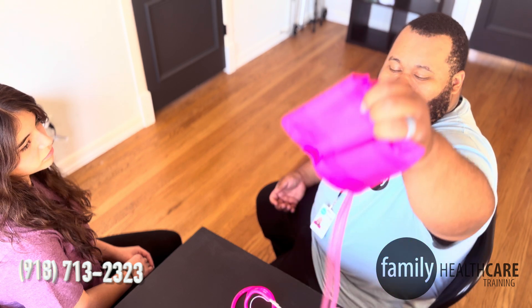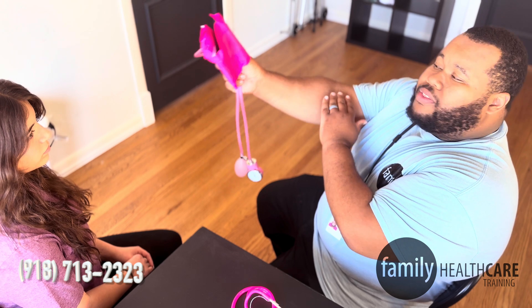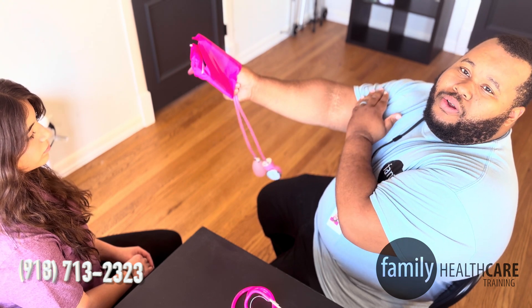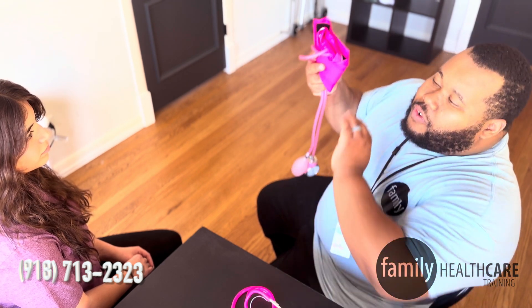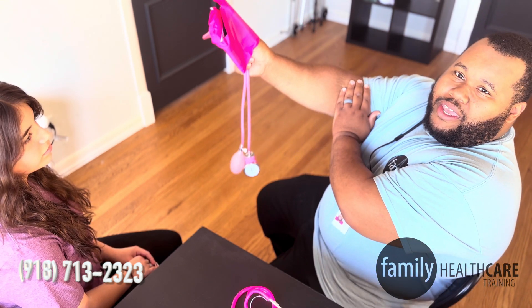Now I'm going to get my blood pressure cuff placed on my patient. As a CNA, we are taking a brachial blood pressure, so we need to put that blood pressure cuff on the bicep so that we can occlude that brachial artery. You may see forearm, calf, or thigh blood pressures in the field, but for the state exam, the only approved spot for a CNA is the bicep brachial.